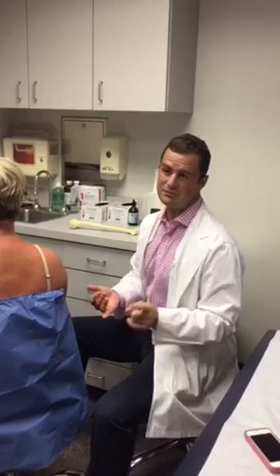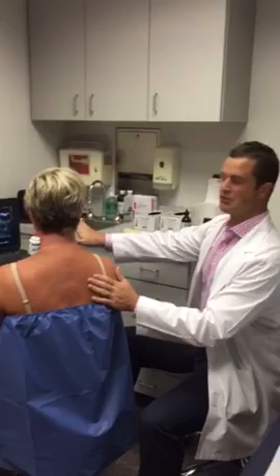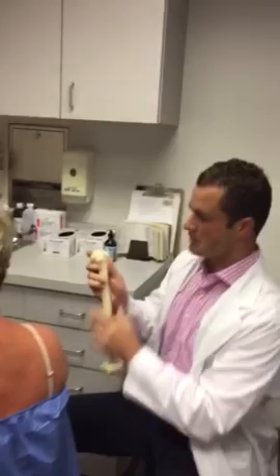We're going to talk today about the ultrasound exam of the shoulder. We're going to go through the full exam and give some tips and tricks on how to identify pathology correctly and examine the entire rotator cuff in both the short and long axes. I have a bone model here that I'm going to use to show some of the osseous landmarks we'll be looking at to start.